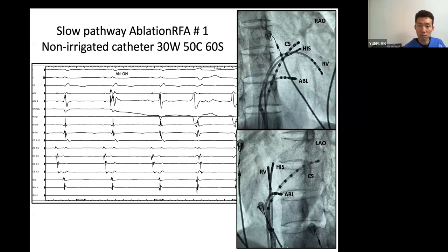Your slow pathway should be a little bit higher, closer to electrodes 7 and 8, and should be more leftward than the His bundle catheter to see the posterior septum. Okay? Yeah. So this site is not a good site to ablate. Second, it is too low. Remember, in the usual venogram they are pretty much crunched together. So it should be higher, more leftward.